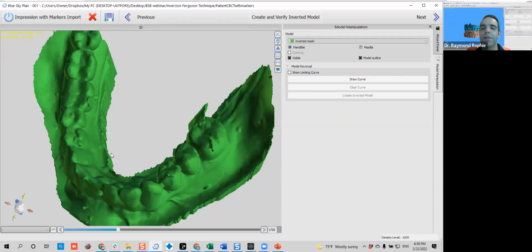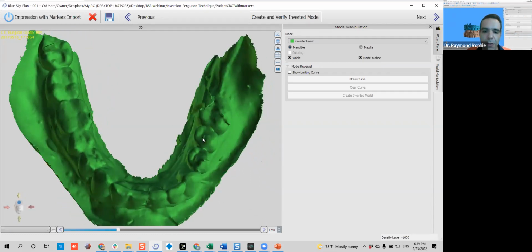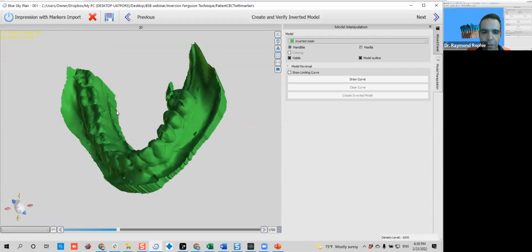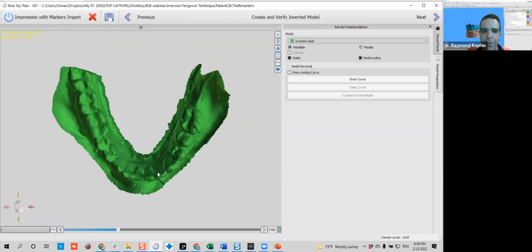So those are the situations, Michael, where I'll choose. Now, if you have, for example, a denture, and you want to duplicate it, or you have a full arch that you want to do, this is a much easier way of acquiring your data than intraoral scan and desktop scan.